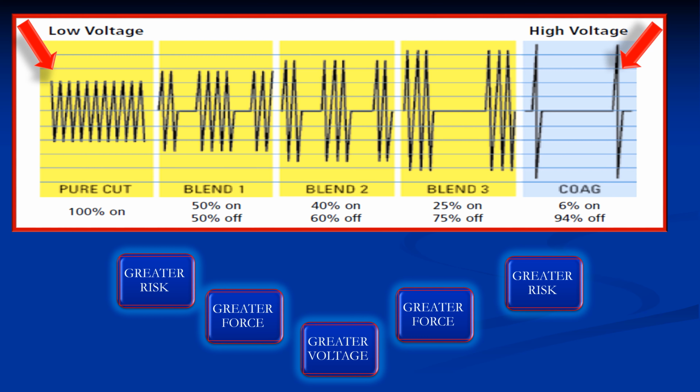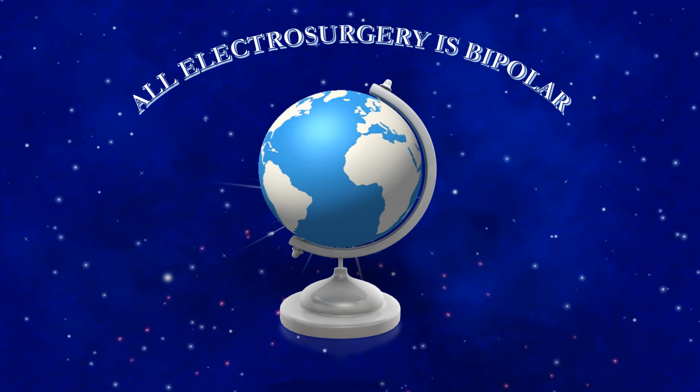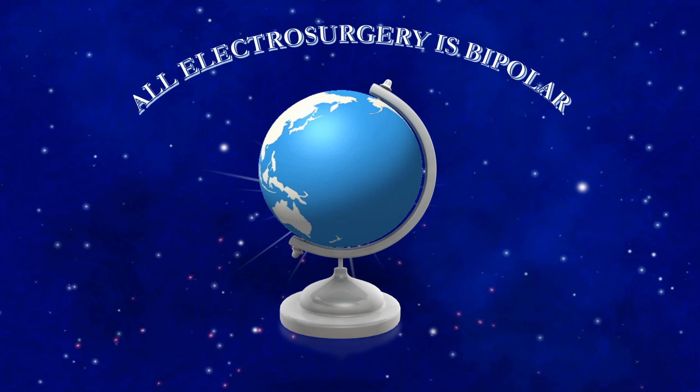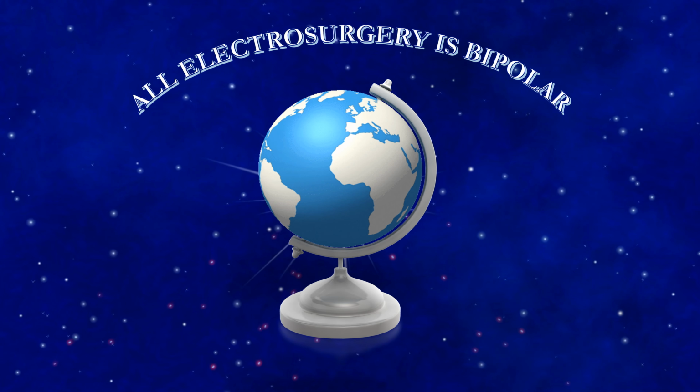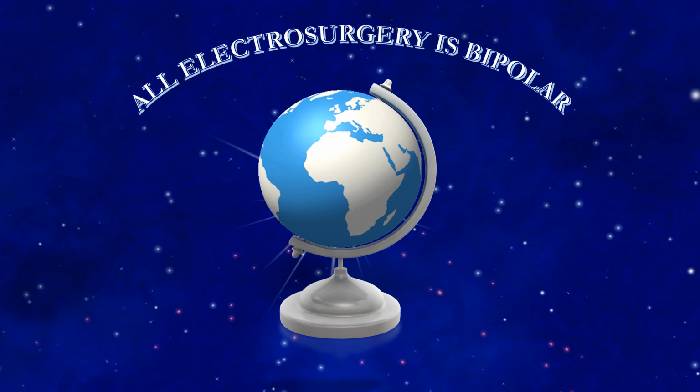Remember that greater voltage means greater force, which means greater risk. So the high voltage in coagulation current is more risky than the low voltage in pure cutting mode. Here it is important to mention, as a general rule, all electrosurgery is bipolar, but the difference is where we can put the return electrode.